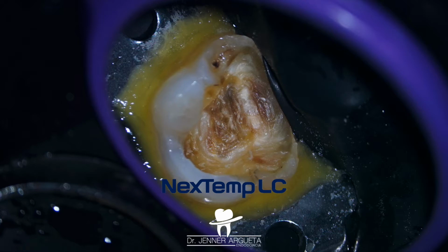The first thing that we did here was to start removing caries, but as soon as we noticed that there was no pulp chamber at all, that the pulp chamber was full of calcifications and that we needed to preserve all the healthy tissue in that tooth, we decided to change from the high-speed bur to a diamond ultrasonic tip.